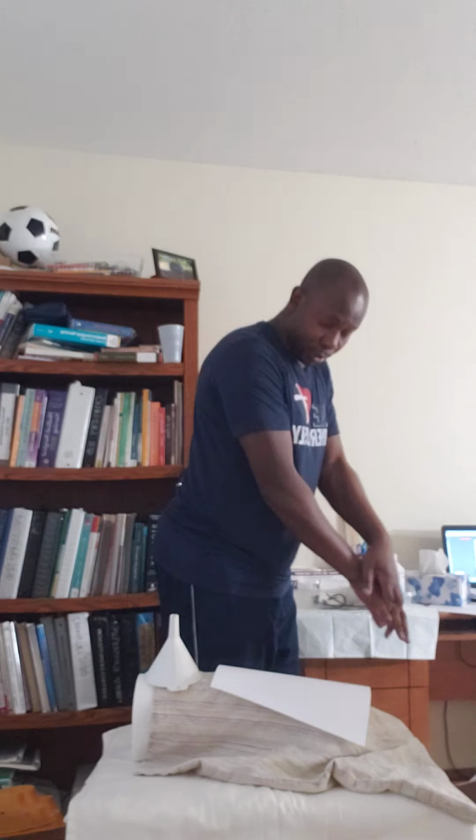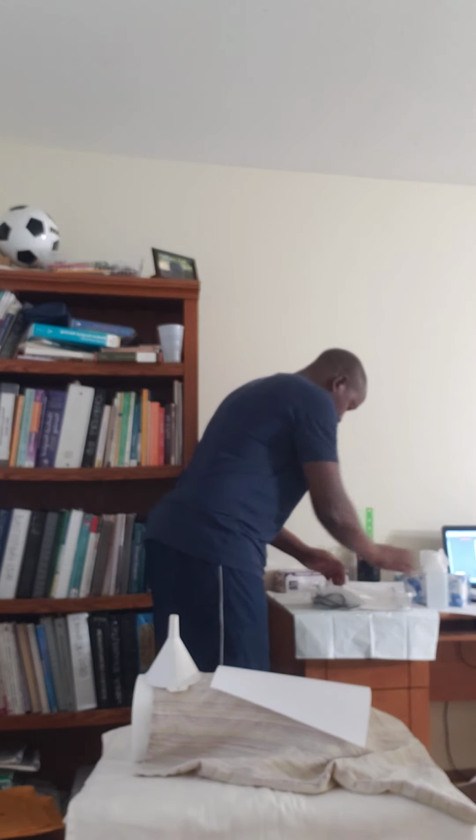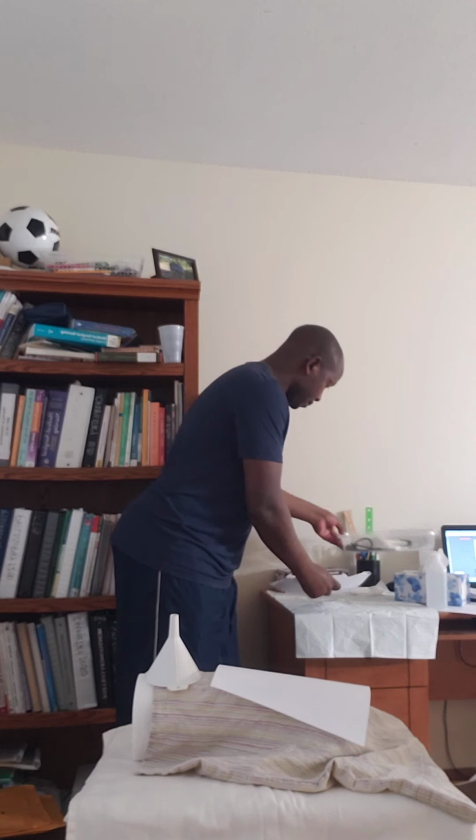I'm going to put on my sterile gloves number 2. These are sterile gloves. By the time I'm doing those things, I'm not touching these things. Everything is sterile. But this is home. I'm at my house, so I'm doing home care, in an environment that allows me to perform good care.